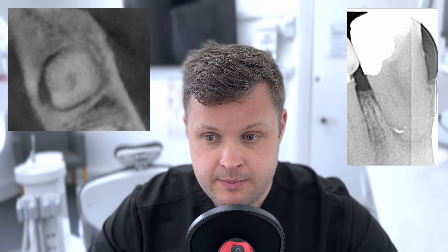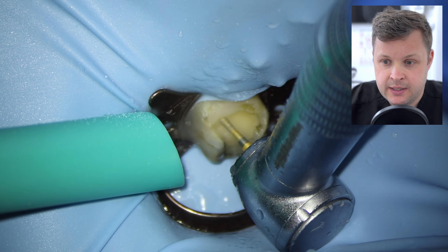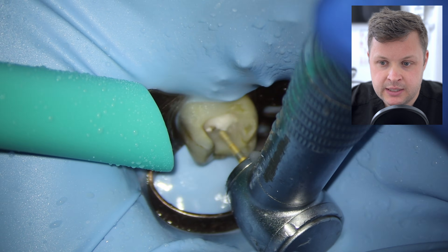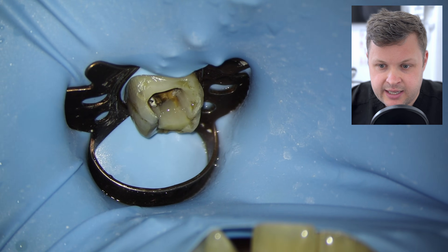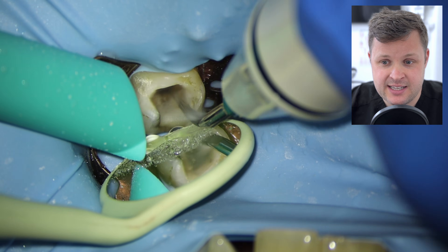Looking at the cone beam CT scan sectionals, you can currently see two obvious canals, but as it reaches down they all mold into one. The case had been dressed previously — I placed a GIC filling — and I'm using an ultrasonic tip here just to clean and open the access cavity.